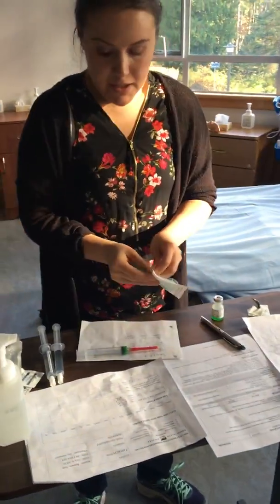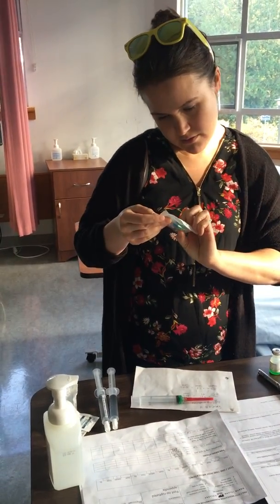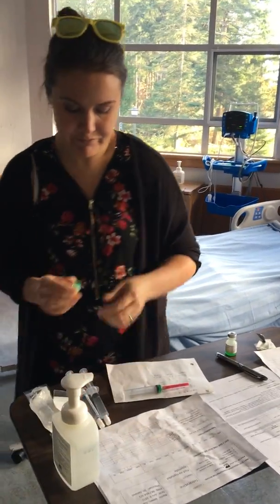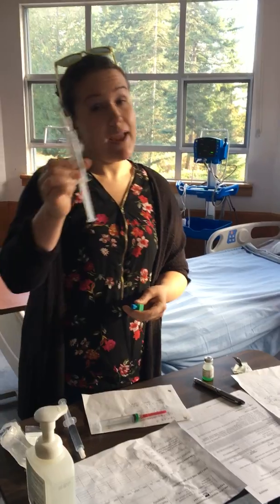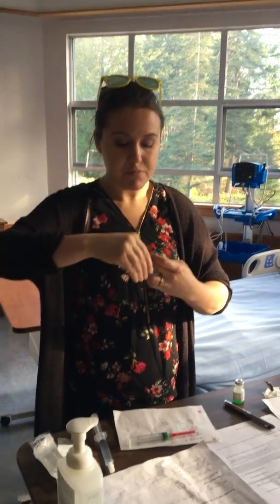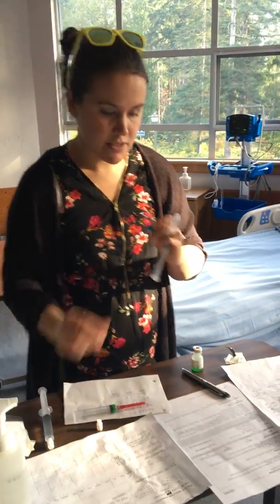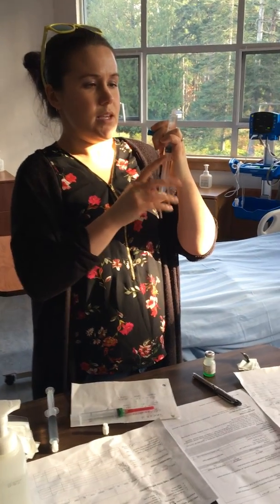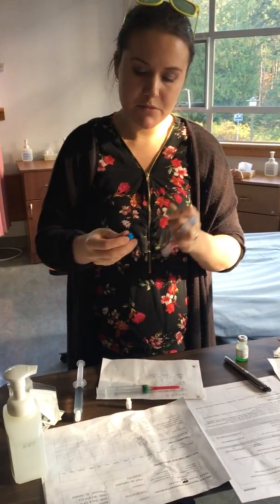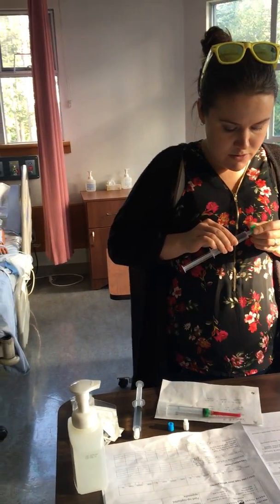So now I'm going to open up my thingamajigger. What's it called again? Fluid dispensing connector. I'm going to get a brand new, still in the package, normal saline. Take this off. I'm going to place this up like this to keep it sterile. Get the air out of it. And take the blue cap off. And I'm using a no-touch technique to connect it.